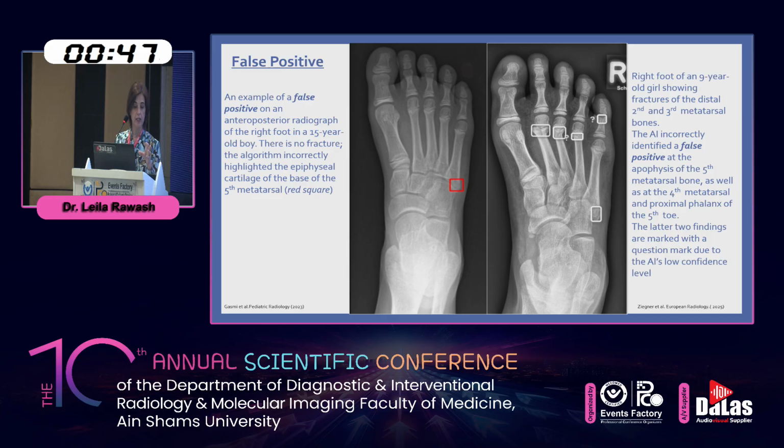Here, it's in red. That's one software, as we see by the paper. And then this is another one, Bone View software as well. But with this software, they have question marks. If it's a question mark, then the AI isn't sure. It's a query, possibly. So AI wants the radiologist to have a second look. AI could be a second pair of eyes for the radiologist. Here they want us as a second pair of eyes.